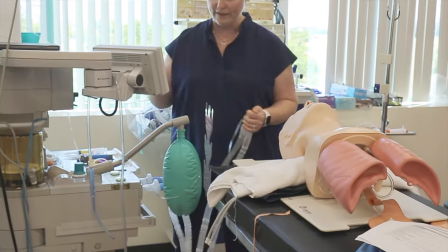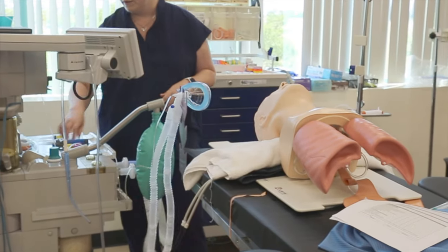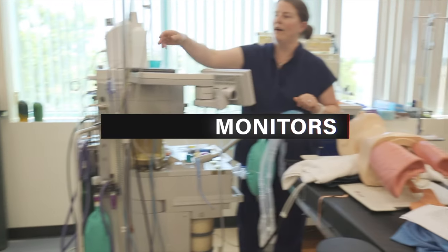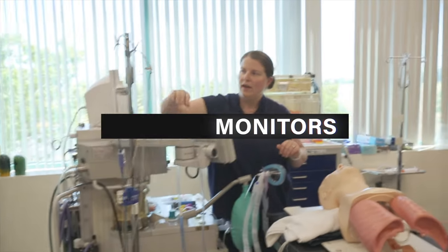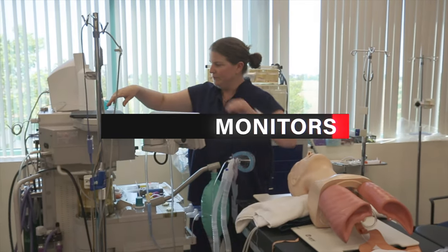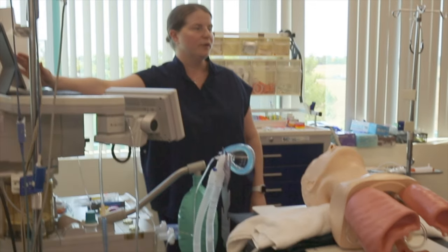And then opening the APL to ensure its function. So that was the first M, machine. Monitors. So you have all of your monitors, EKG, SpO2, and blood pressure. You have all of your monitors up here with the appropriate alarm settings.